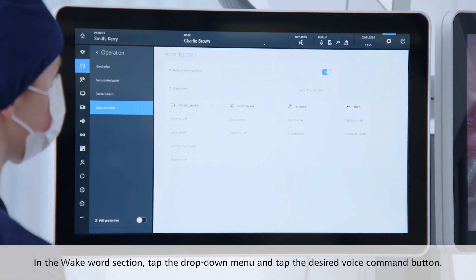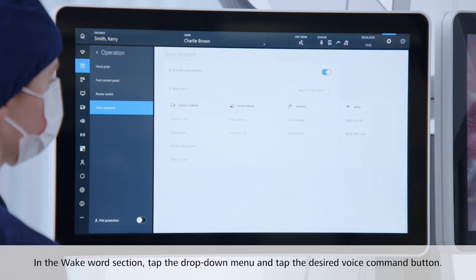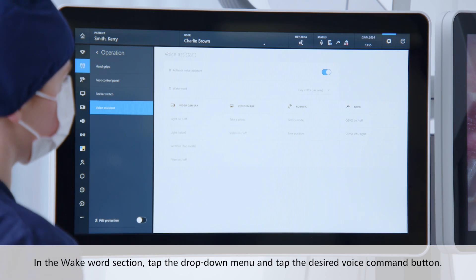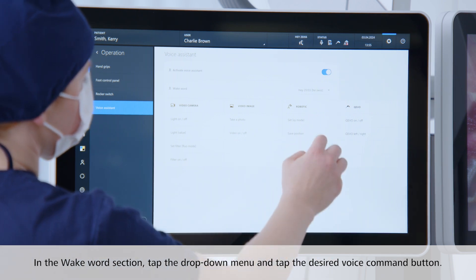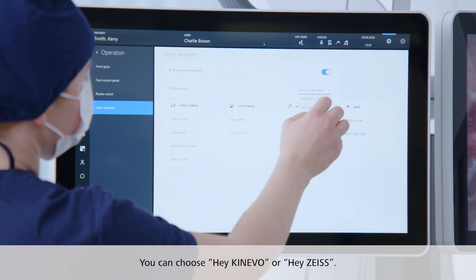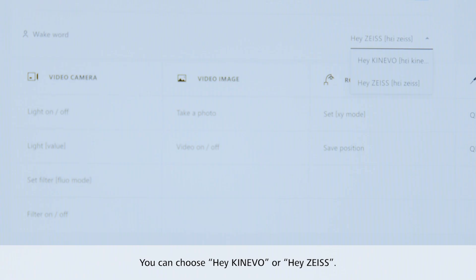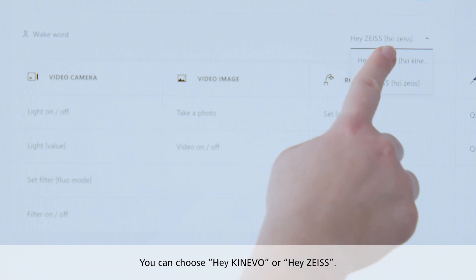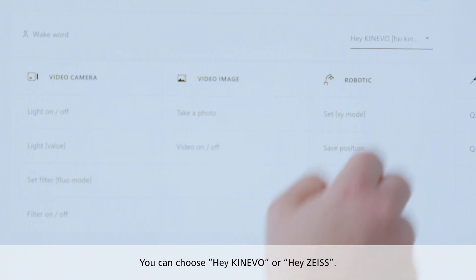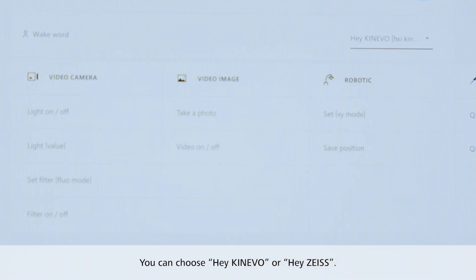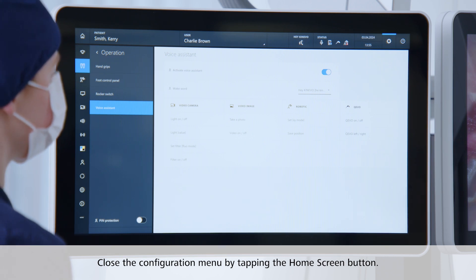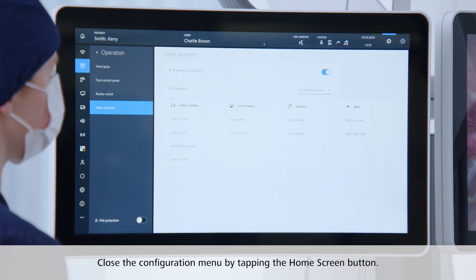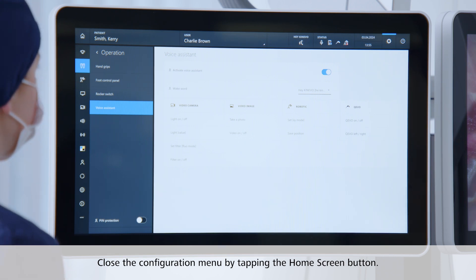In the Wake Word section, tap the drop-down menu and tap the desired voice command button. You can choose 'Hey Kinevo' or 'Hey Zeiss'. Close the configuration menu by tapping the home screen button.